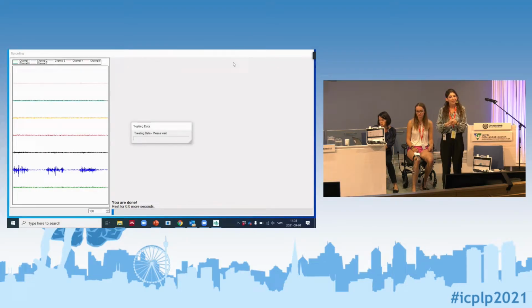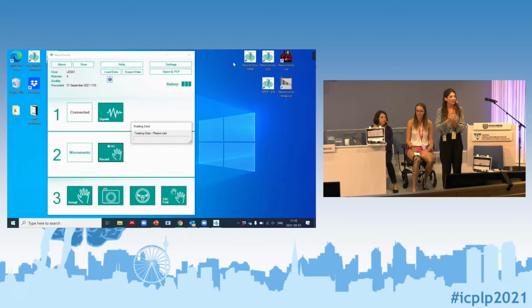Therefore, the recording session is also quite important. I know I'm saying everything is important, but it's true. You need to check everything. Okay, so once we do the recording, how do we know that the recording was good?